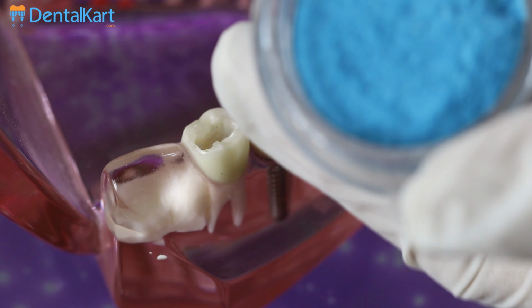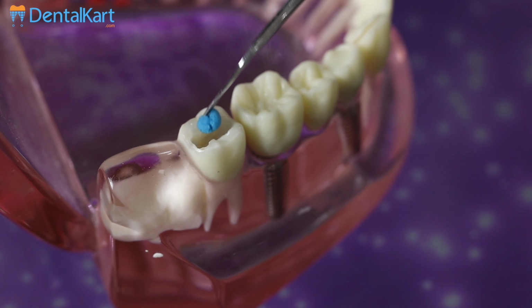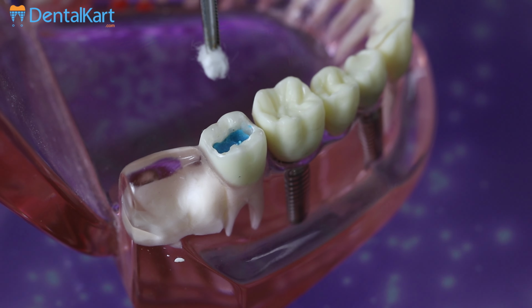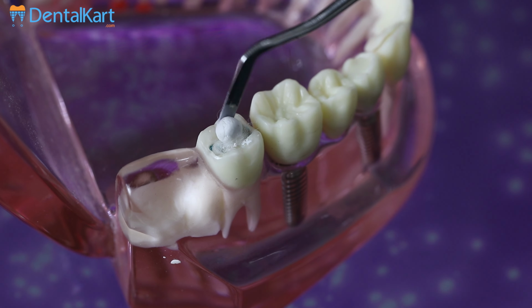For the application of Waldent Devital Pulp Devitalizing paste, take a small quantity of paste and place it inside the access cavity. Then insert a cotton pellet over it and seal it hermetically with temporary filling.